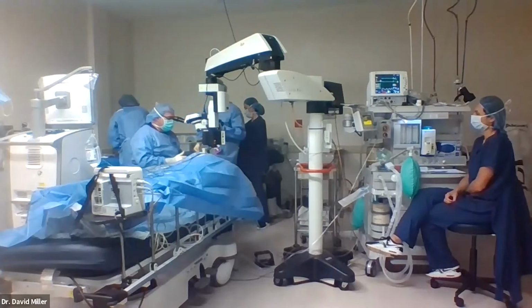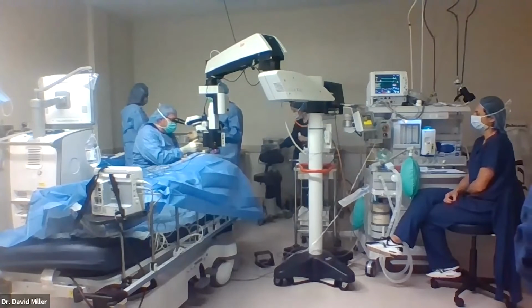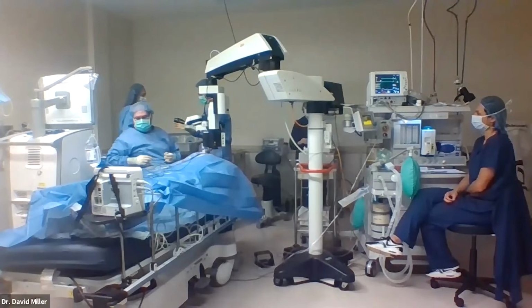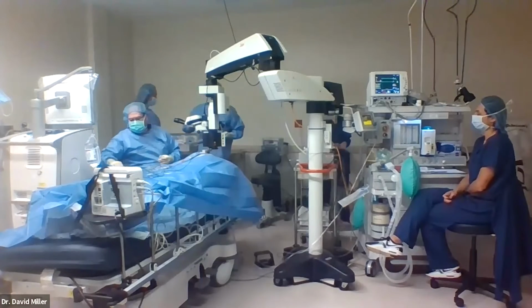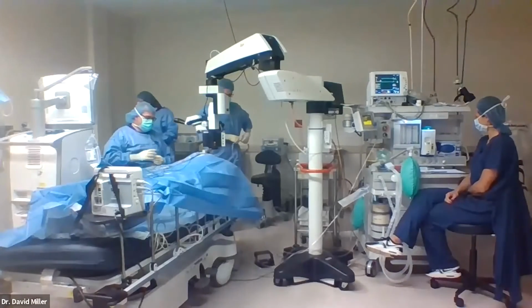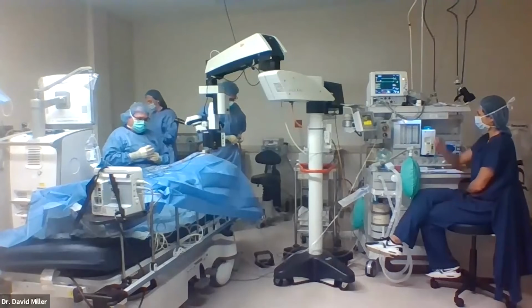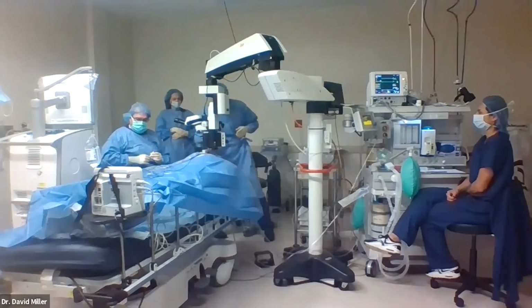Also, why did the retina redetach, right? The bubble's at half, and we see his retina's coming back off. I did not do his first case, but what we're suspecting is that there's an open retinal break somewhere that, as the gas bubble is receding, is uncovered. Another possibility would be some early PVR, proliferative vitreoretinopathy, in the inferior half of the retina, creating a new break. So we're either going to look for PVR inferior with a new inferior break, or a break that developed or was missed in the first surgery, perhaps. And we'll see.